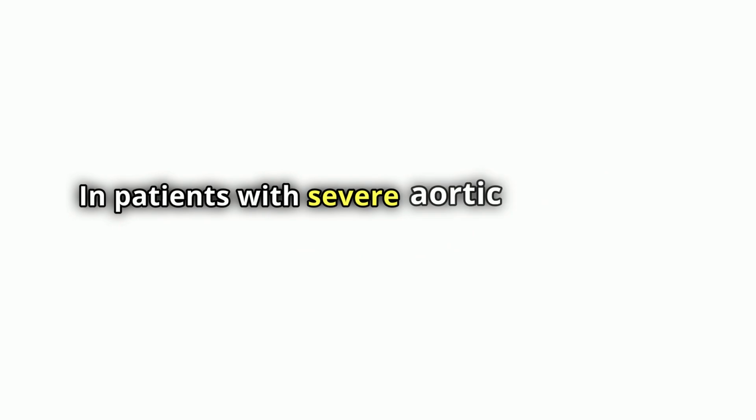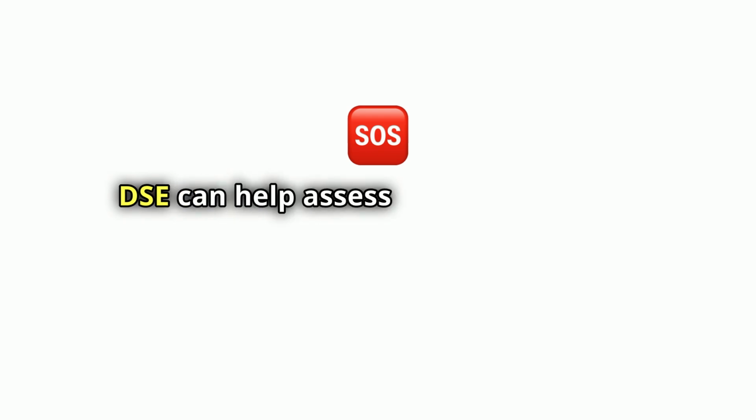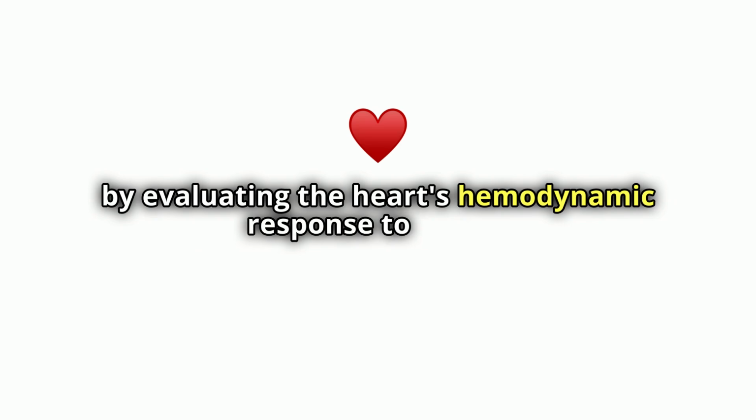In patients with severe aortic stenosis who are asymptomatic, DSE can help assess the risk of future events by evaluating the heart's hemodynamic response to stress. Identifying reduced contractile reserve or other abnormal responses during DSE in asymptomatic patients might suggest a higher risk of progression and can influence the timing of aortic valve replacement, even in the absence of symptoms.